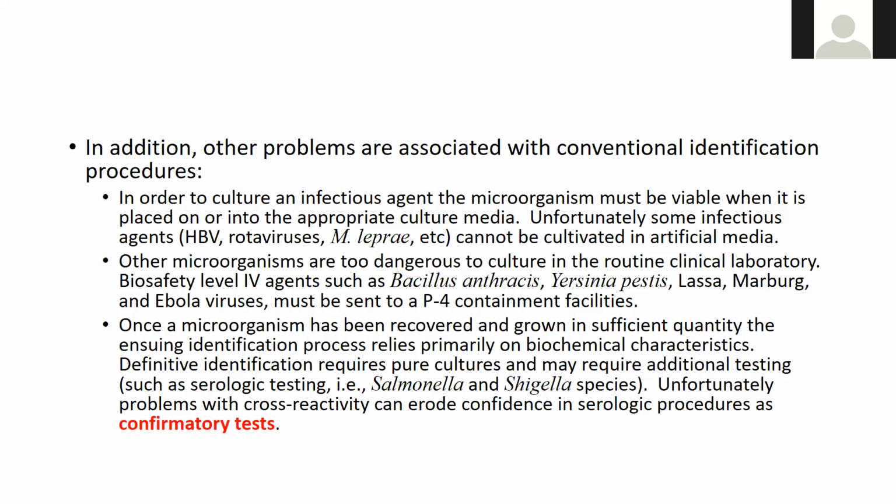Additionally, we have other problems with conventional ID procedures. The organism must be viable when it's placed on the appropriate culture media. I had one last weekend that didn't ID. It ID'd very weird, like 30% ID. I went back to the purity plate and checked it. Lauren helped me out, she was working with me this weekend. We went back and looked, and there was nothing growing. Somehow we missed a day on that one because it didn't get transferred over. It did ID eventually the next day, so it's good. We ended up finishing that one up.